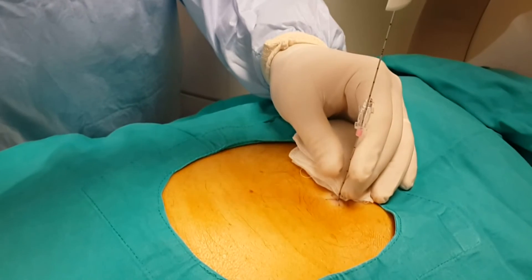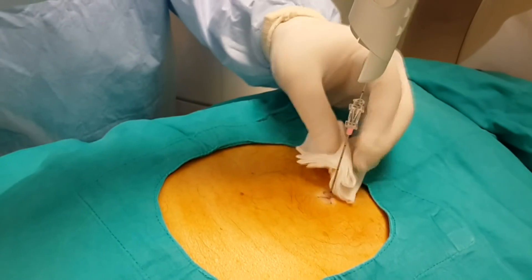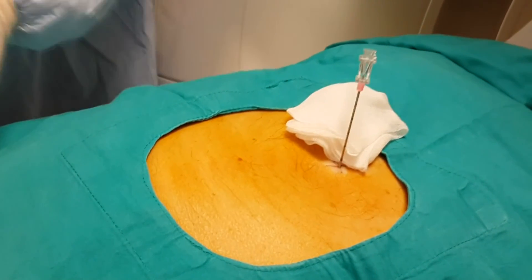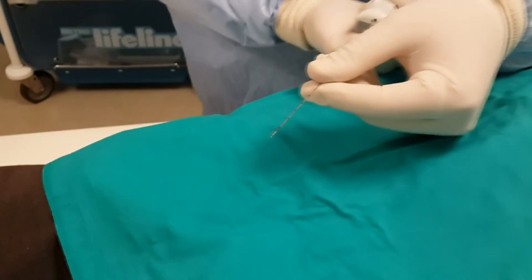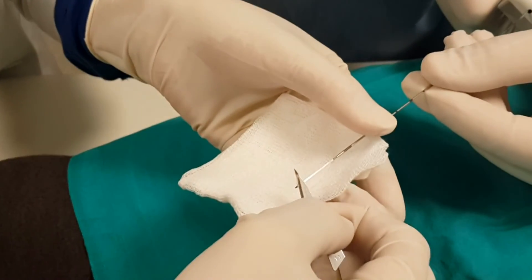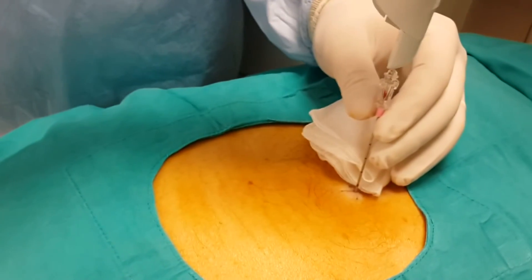Now it is time to obtain biopsy samples. To get biopsy samples, we advance the true-cut biopsy needle through the larger needle and get a small piece of the mass. We can repeat this maneuver as many times as we want. In this way, we can obtain multiple tissue samples with a single needle placement.